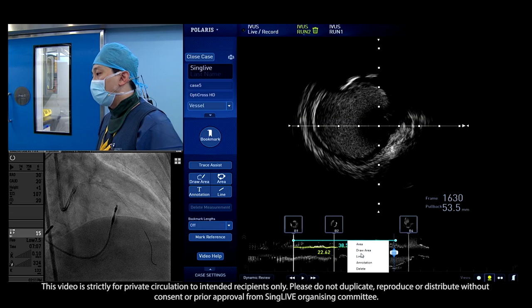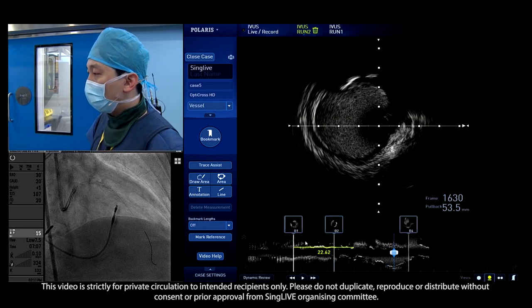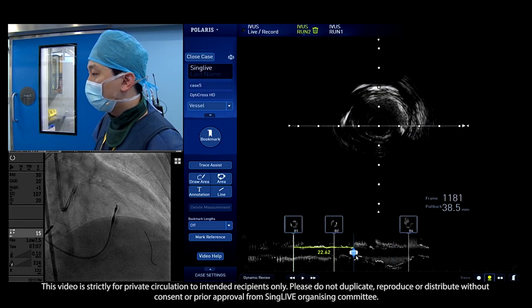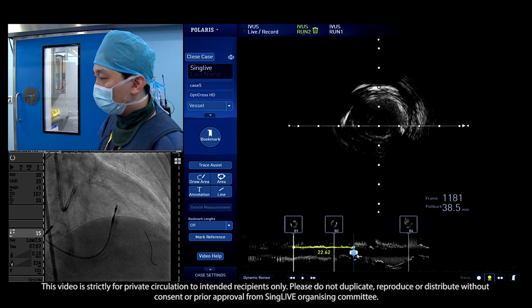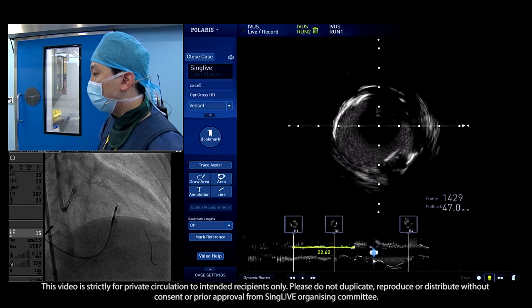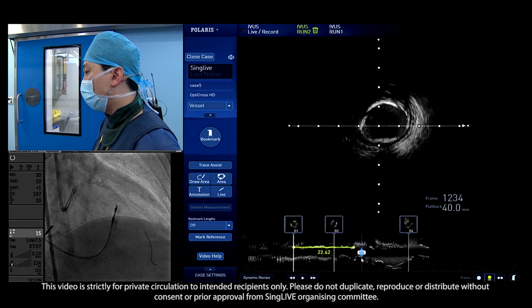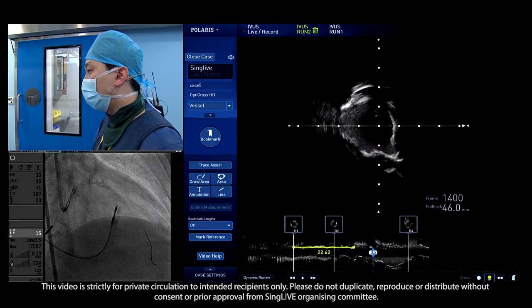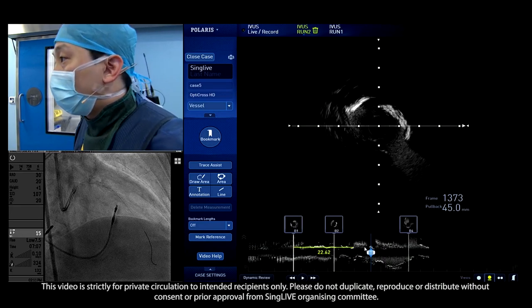So we discussed a lot and decided to put two stents: one for the smaller LAD to the proximal LAD here, then treat the diagonal branch bifurcation and do all the optimization, and put another stent of bigger size for the left main bifurcation to cover up to the left main ostium. We did not evaluate the circumflex with IVUS yet, and here we resume the procedure.